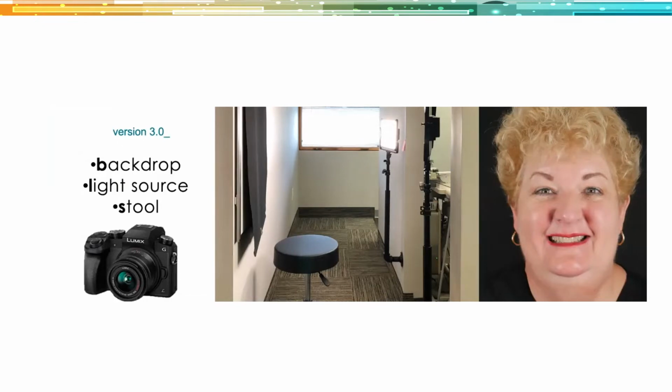We had one of our local contractors come and just make these custom metal tubes that we can put these things into, and they're ready to go. So when we're ready to do something like this, we have a patient that's interested, we just say, we're going to take the DSD smile design photos. We bring this little stool out, we turn on the lights.